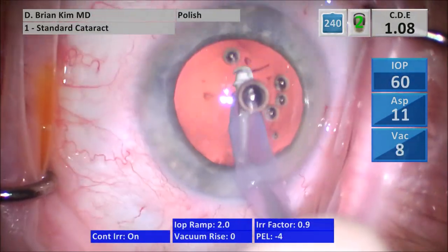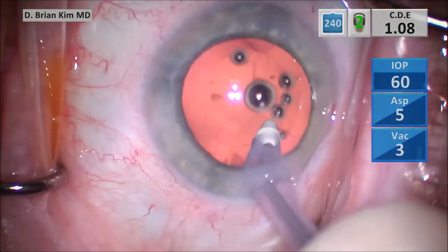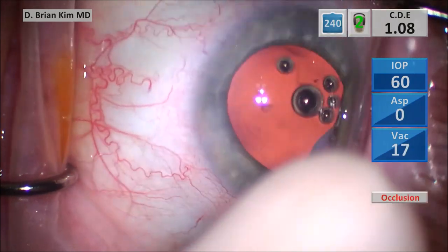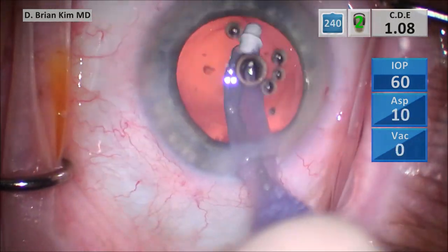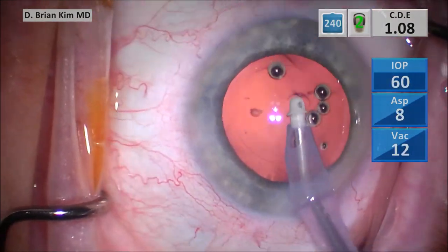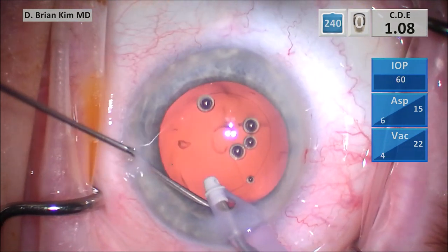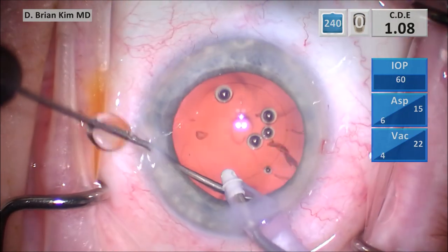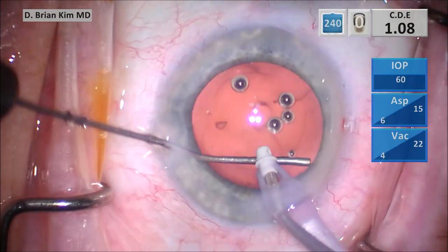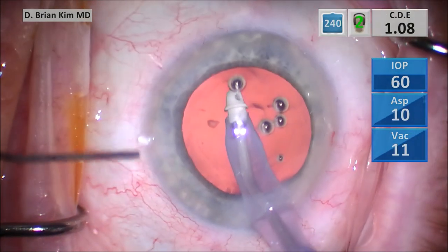I switched to the polish mode. Now I'm removing the cortical material from the posterior capsular surface with the port down with this polymer tip. I'm able to be very confident and remove all of that visible lens material on the posterior capsular surface and sweep the anterior capsule as well. I'm using a BSS cannula through the paracentesis going into the sub-incisional capsular fornix and pulsing BSS. You can see there's cortical material that's liberated doing this technique. You can certainly do a bimanual INA, but this is an extra step — you'd have to remove and switch instruments.